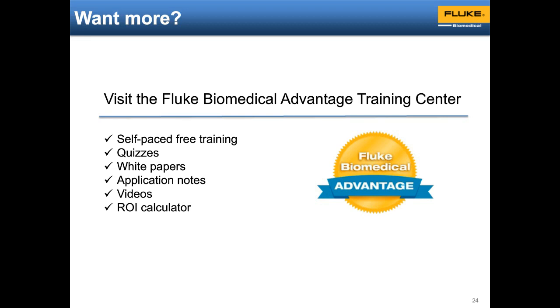And typically, even with the disposable sensors, they're meant to go on a finger or on a pediatric or a neonate, or perhaps in other applications, you might put it on the ear or other place where there's an arterial pulsation. I'm not familiar with that particular monitor, but usually it's incumbent upon both us as a test equipment manufacturer and the manufacturer of the monitor to work together to get the R curves into the devices for our common customers.